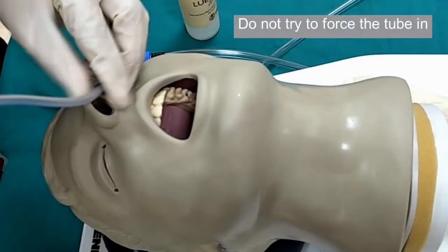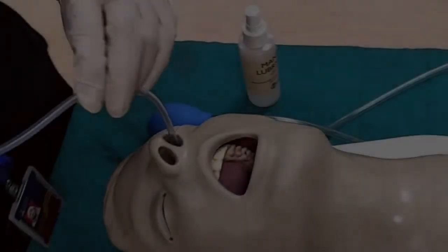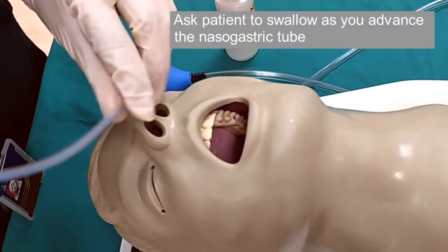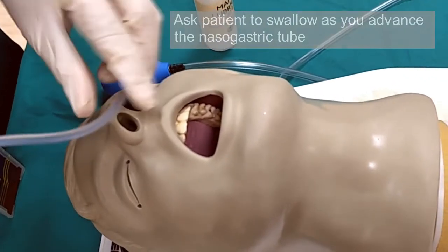If the patient becomes distressed or is gagging, pause and allow the patient to relax first before proceeding. It's useful to look inside the patient's mouth intermittently to ensure that the nasogastric tube isn't coiling in there. If the patient is cooperative, ask the patient to swallow as you advance the tube, as this can help facilitate insertion.